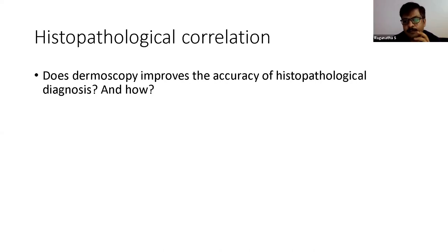What about the site of biopsy? That's also a good thing. If you want to differentiate between psoriasis and some other eczema, you start looking for the dermoscopic site of biopsy. If you find classic dermoscopic features of psoriasis at one place and take a biopsy from that area, that will definitely show psoriasis clearly, rather than a modified zone like the elbow, some frictionated area. Similarly, in alopecia areata, the active margin can be selected. You can see the exclamation mark hairs and take a biopsy from that site. For lichen planus, you can see the Wickham striae and take a biopsy from that.